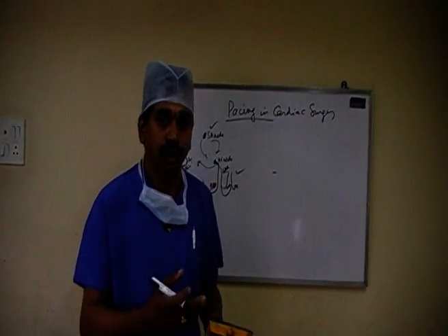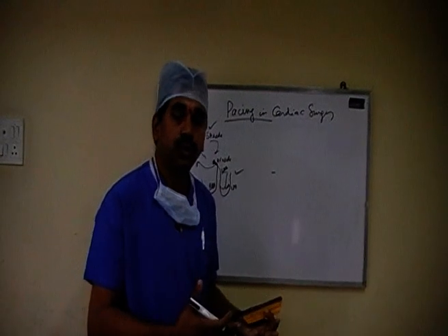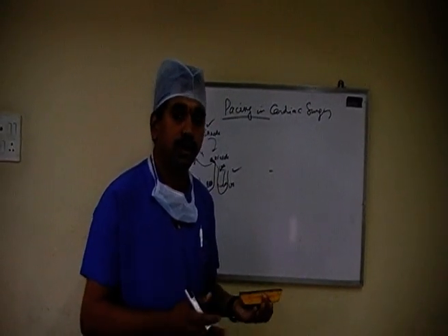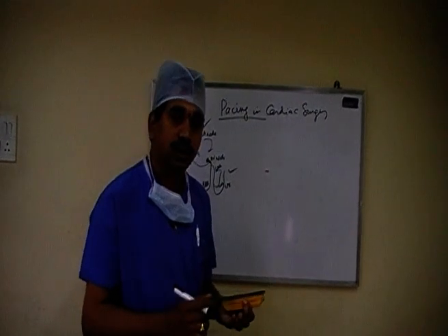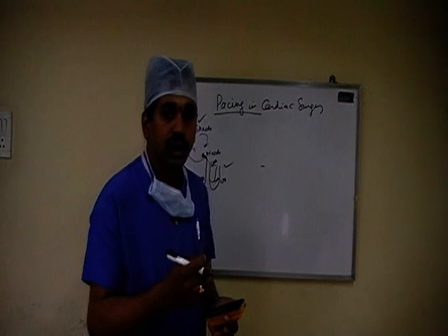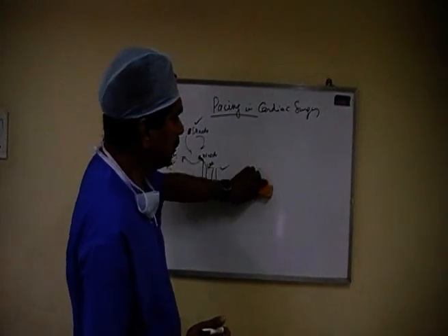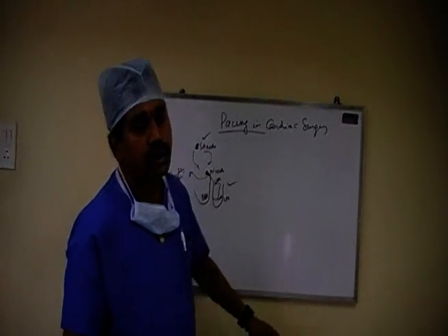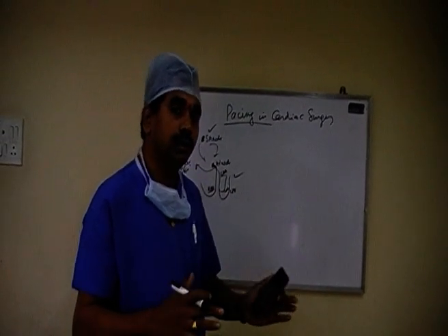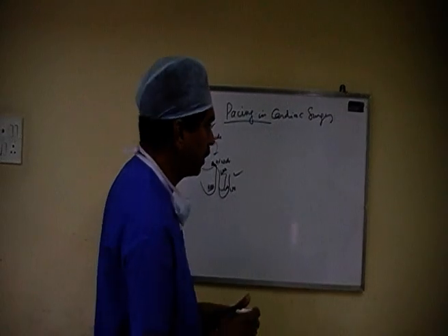Some surgeons only prefer it to be cut because they have fixed it in such a way that if you pull, it can damage the epicardium and make the patient bleed. Or some surgeons prefer the wire to be pulled out in its entirety, so that they have only fixed it very lightly on the heart. Either way, you need to know from your surgeon how the epicardial pacing wire has been fixed, so that you know how to remove it.